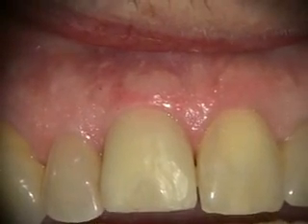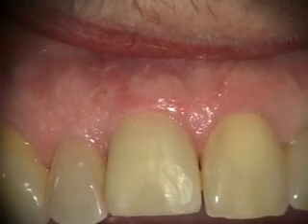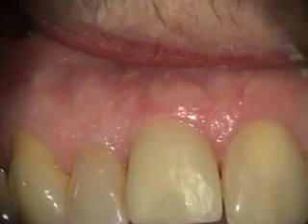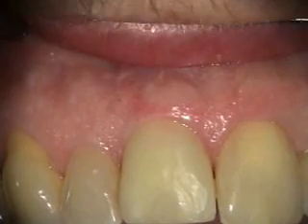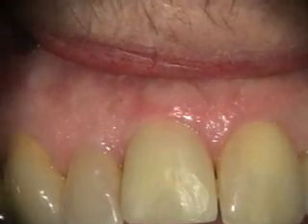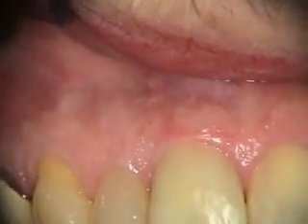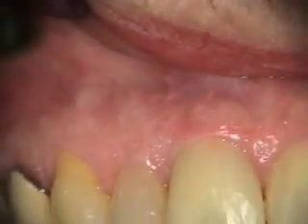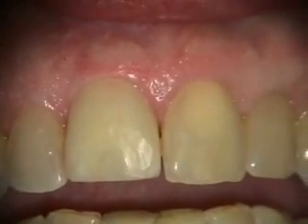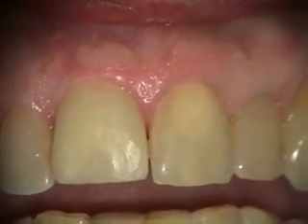This is a two-month post-op of the immediate extraction and immediate implant provisional on number eight. At the same time there was a perforation at the buccal, and you can see how that repair area healed — and that's looking really good. You can see she's got just the tiniest little bit of a scar there. She's going to be going for the final restoration any time now.